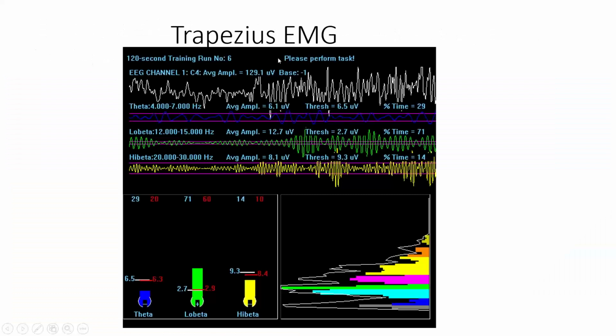All right, now here's a trapezius on the BrainMaster software. I just had this kicking around and I was kind of in a hurry, so I pulled this and threw it up there. It was a very, very good example. You can see the morphology here of a nice regular EEG. But you can see they're starting to get those high peaks that you start to see in the lower frequencies. It may be in high alpha amplitudes and low beta amplitudes, and then you transition into this EMG.